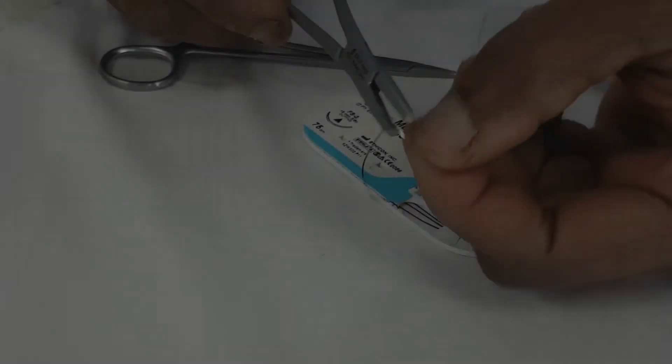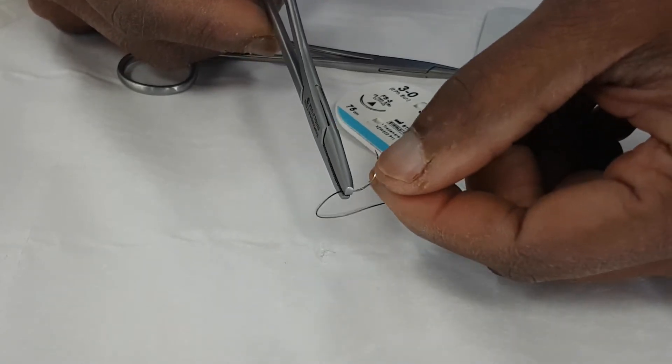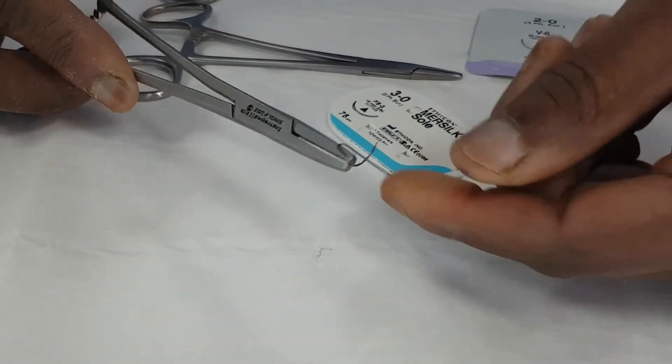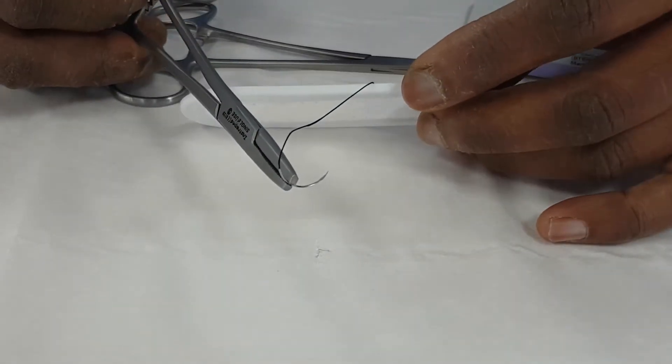And you might be able to just see that the point to actually put the needle holder is two-thirds the way down the stitch, one-third away from the end. So it's a two-third, one-third ratio.